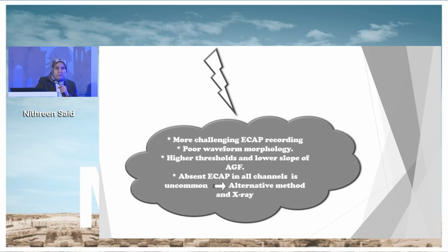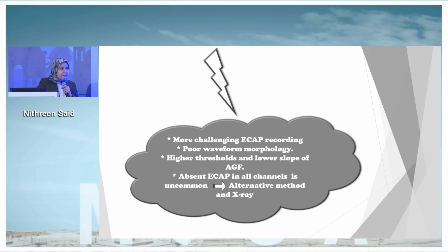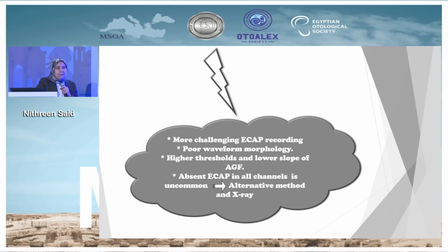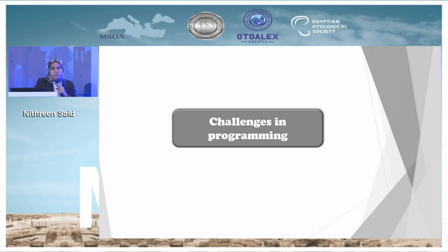So if we couldn't elicit ECAP, we have to change the parameters of the ECAP to get more clear responses, or better to use an alternative way like ESRT or electric ABR, and X-ray is usually recommended in patients with inner ear malformations, especially the severe malformations.